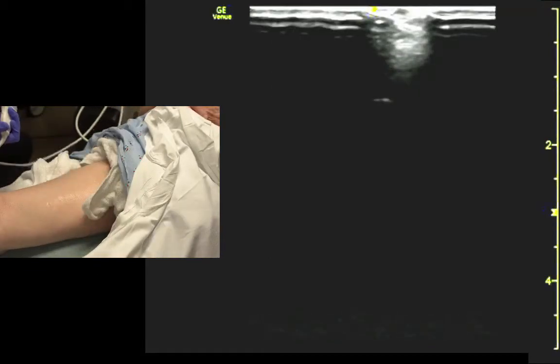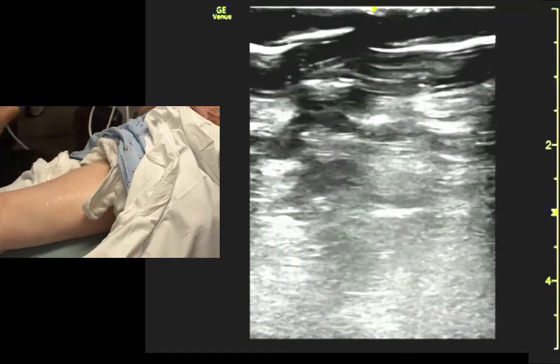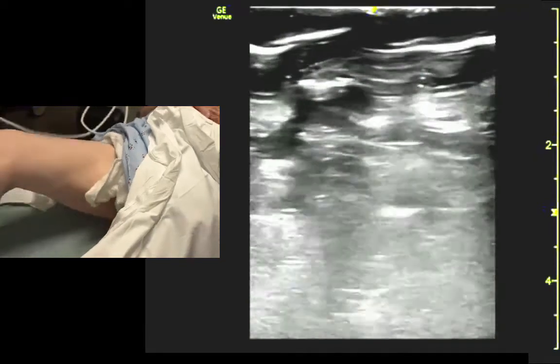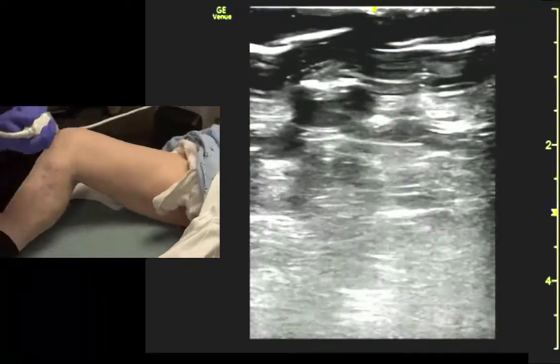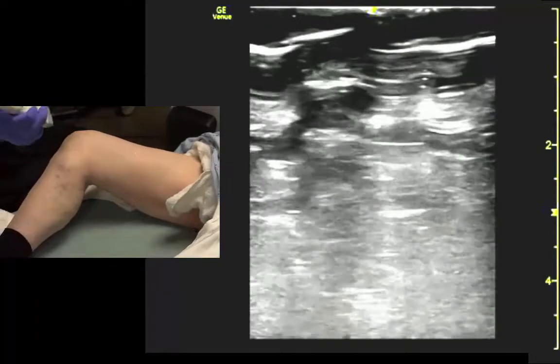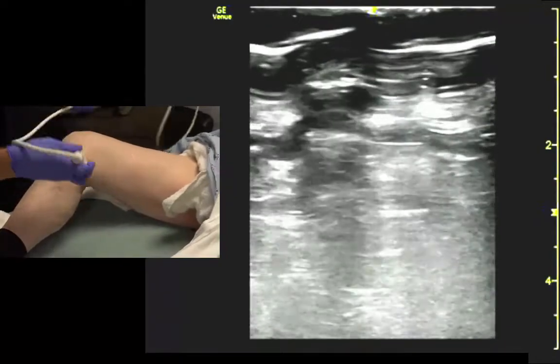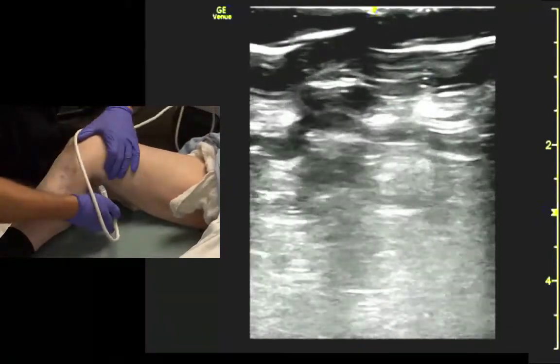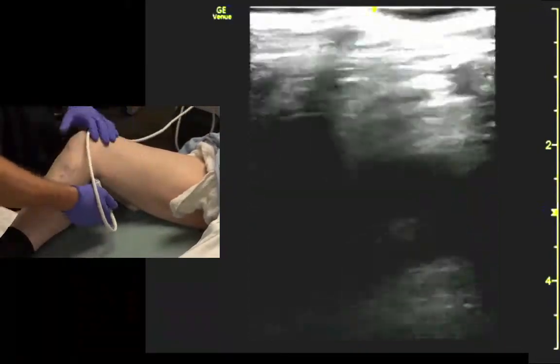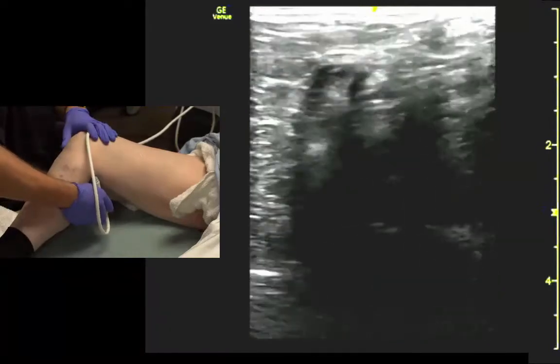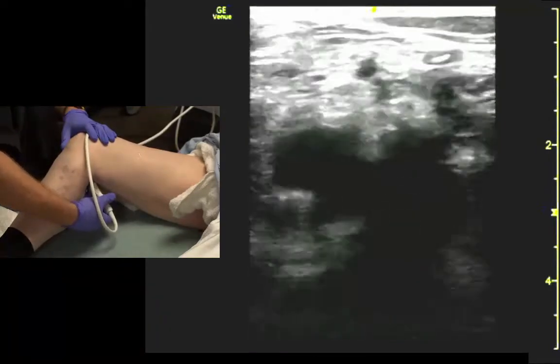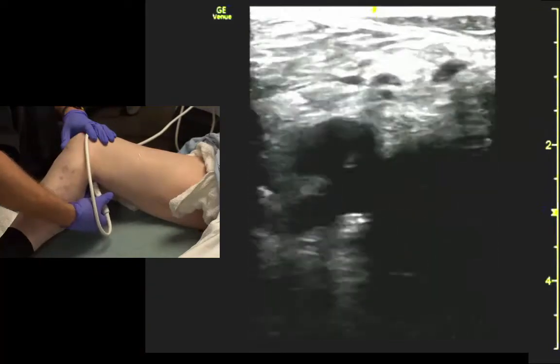We get into the popliteal fossa. I'm just going to have you bend a little bit here. Just grab the transducer however you're holding it and get right in the crease. Identify the vessels.